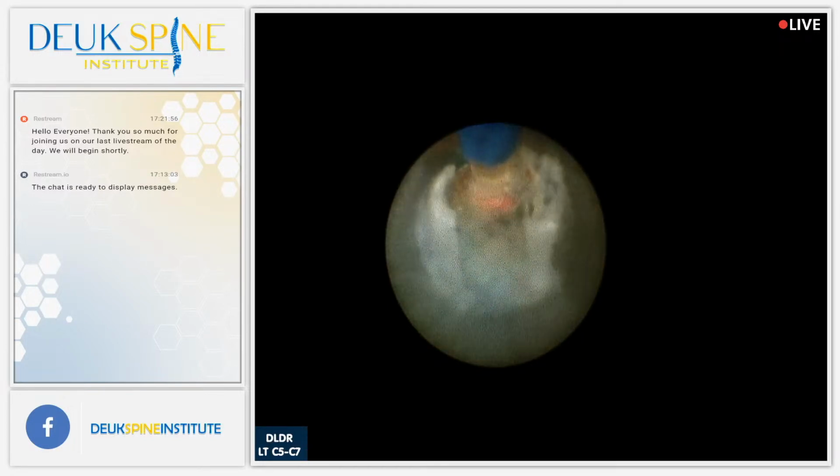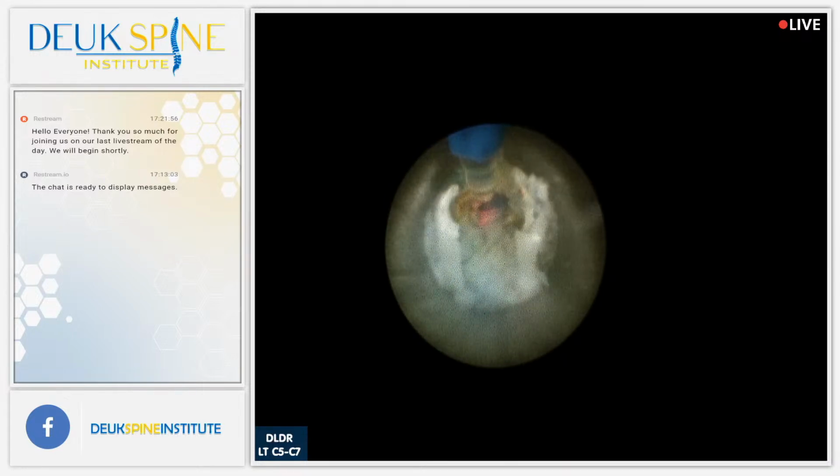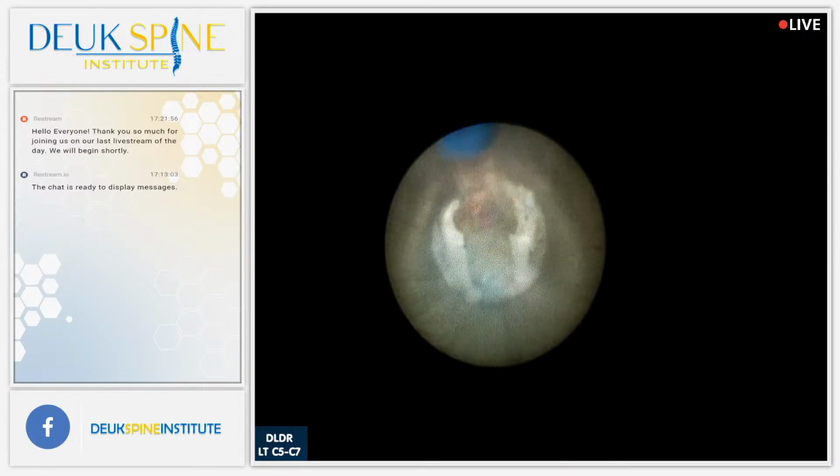Any questions from our audience? No current questions. Let's show the audience how this surgery actually works.